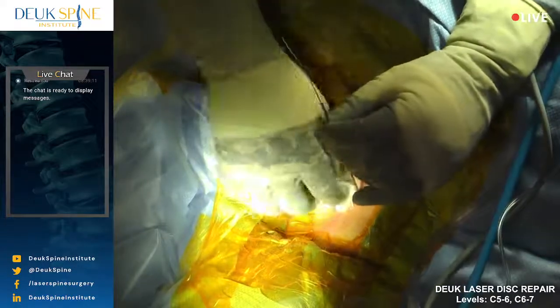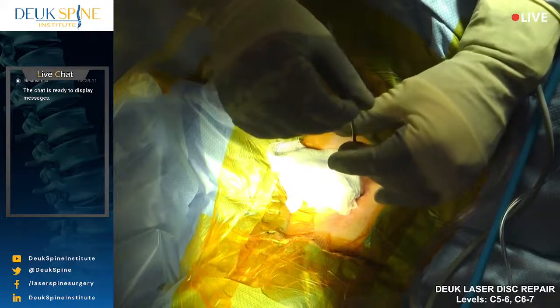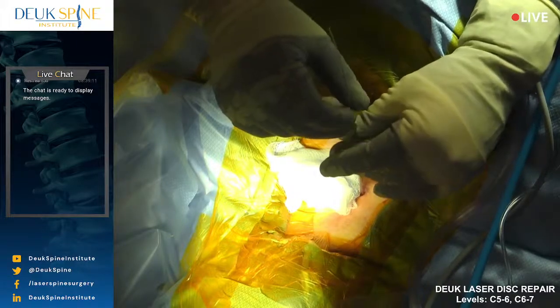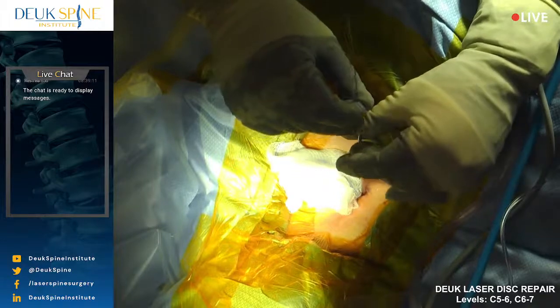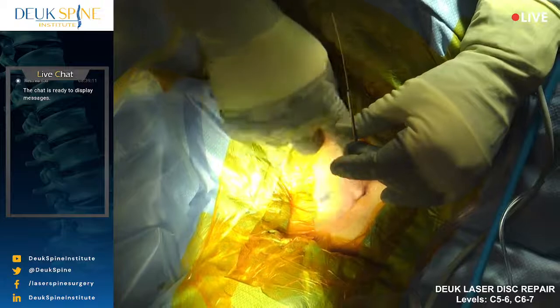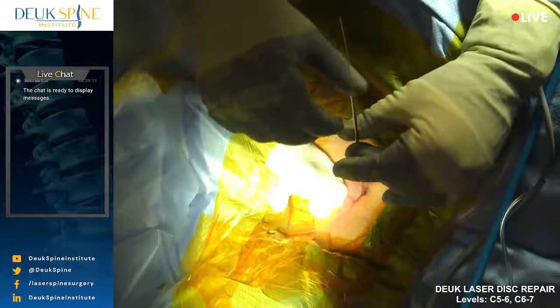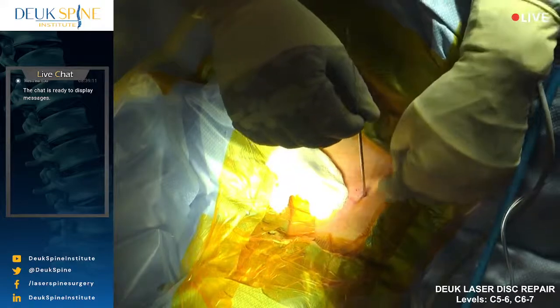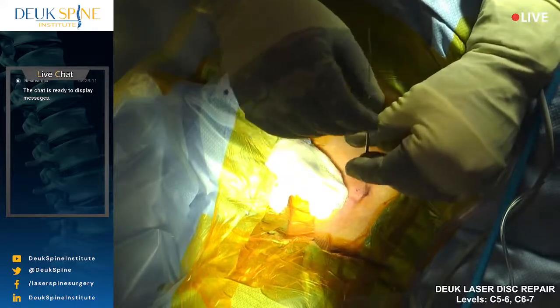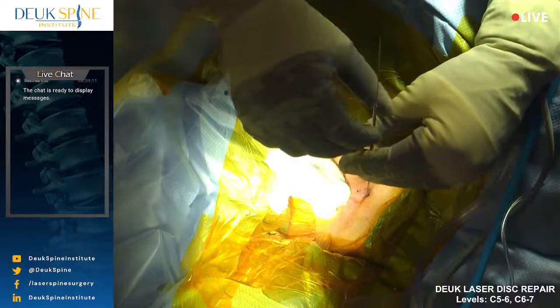And I know it's safe because the way I placed the needle, I did it in such a way as to create a safe passageway. It's only about 1 millimeter wide. And over here to the side is the carotid artery, the carotid sheath with the jugular vein and the vagus nerve, and then over here medially is the trachea and esophagus. So I'm going between the trachea and esophagus, the carotid sheath and its contents laterally.